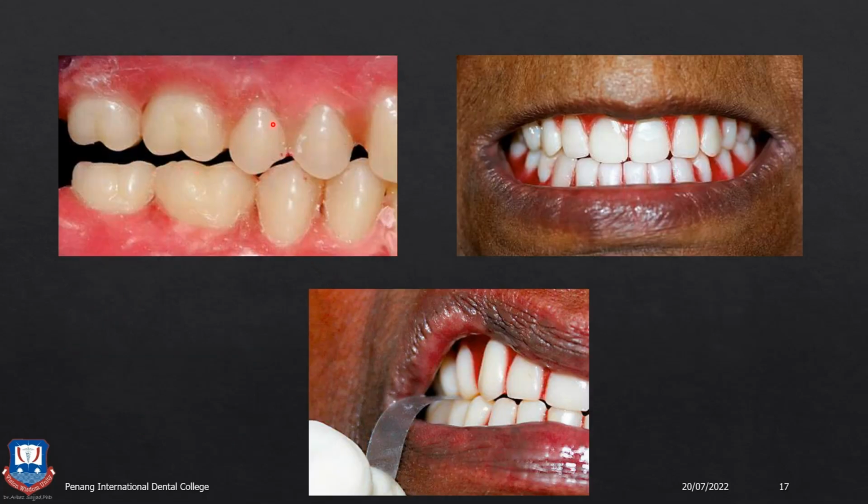So say this is a scenario where patient bites in maximum intercuspation, that is in centric relationship. But when you see the centric occlusion, you see that there is a posterior open bite. The teeth are not in contact. This could be due to an error in the secondary impression. This could also be due to an error most likely during the jaw relationship step. That is, maybe the heels of the denture were touching prematurely before the wax rims came in contact, or the patient did not give a proper centric relationship, or the record bases were faulty and distorted. This could result in something like this.